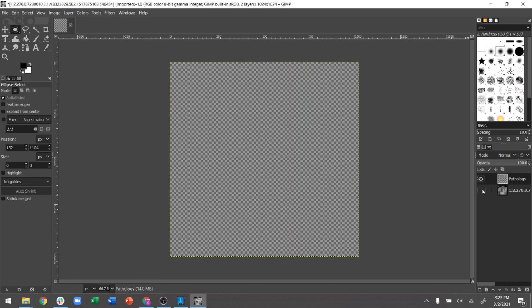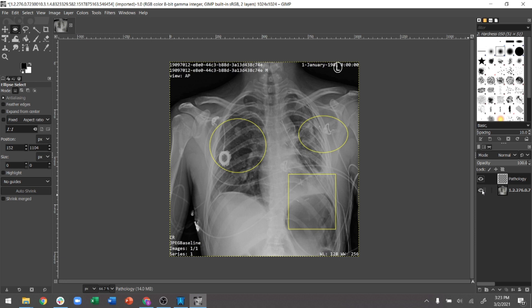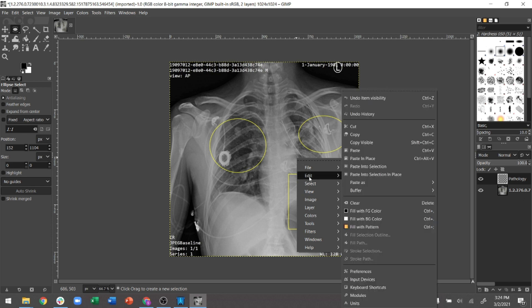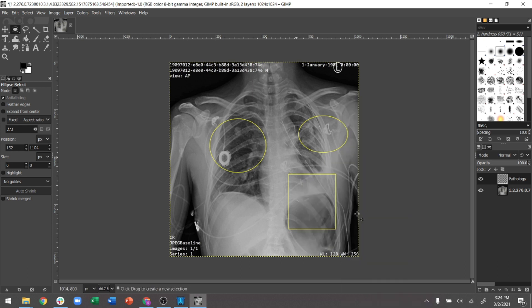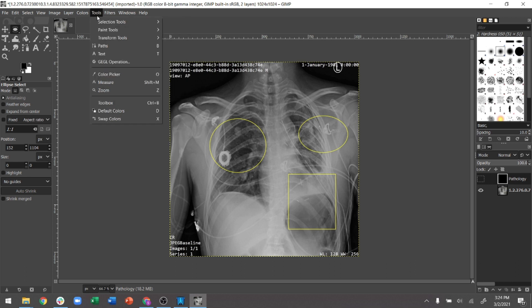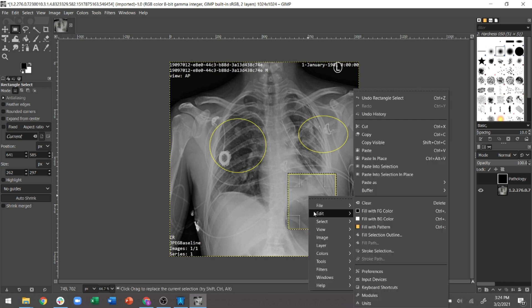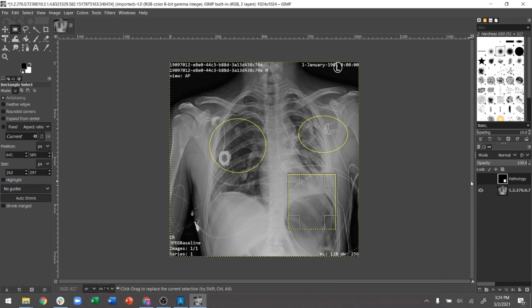Looking at the layers panel — which is very similar to Adobe — you can have layers and color them. For the pathology layer, I first fill the background, then go to Tools and select the rectangle selection tool for rectangle regions of interest. Once the selection fits with what the specialist annotated, I go to Edit and fill with white color. You can overlay it on the original to verify the annotation is correct.